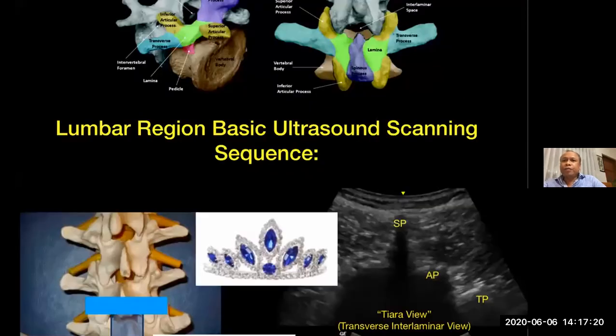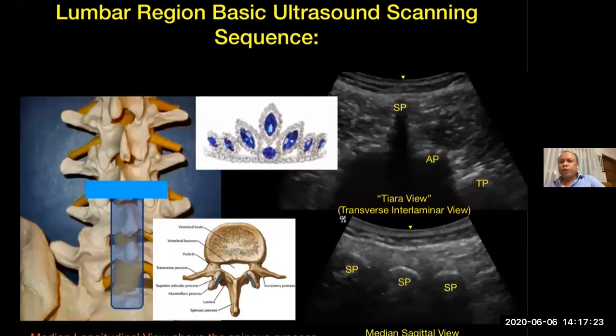And here, when we do an ultrasound, we have to follow certain patterns. And this is a very simplistic way of scanning the spine to make it easy for us to remember using different images that look like it. For example, if we are looking at the lumbar spine, a transverse view, referencing it from the spinous process, we can see both right and left, and you can see the peak, which is at the middle, is where the spinous process is.